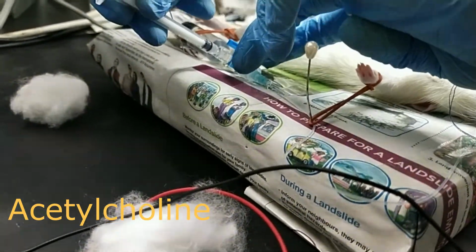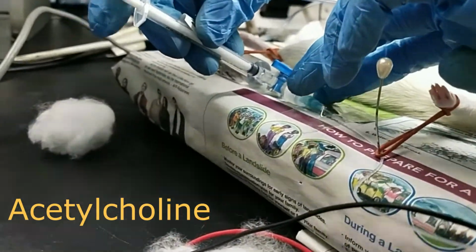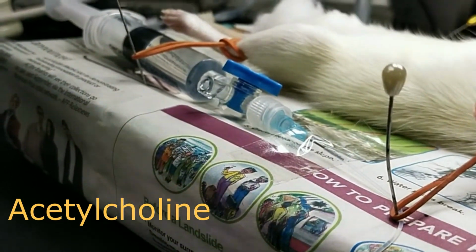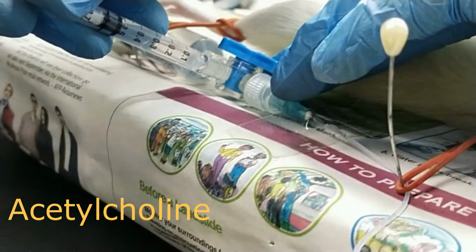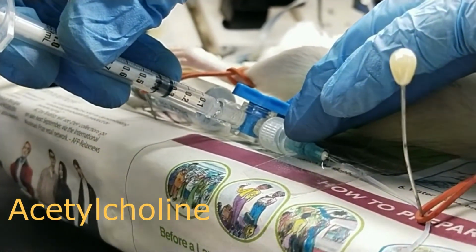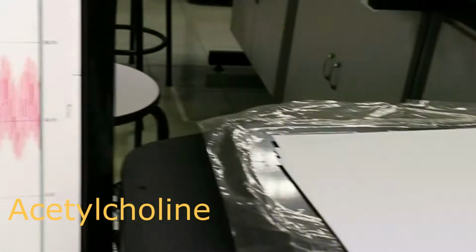Whenever you are ready, we're going to pump the drug into the system, and we're going to use the same method. You need to flush the drug using 0.5 ml of normal saline as well, and at the same time you need to see the effect on the blood pressure after we introduce the drug into the system.